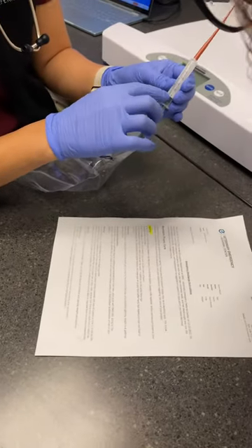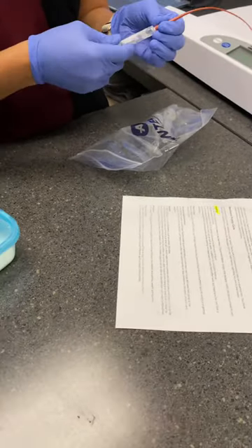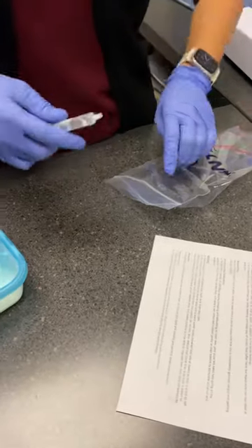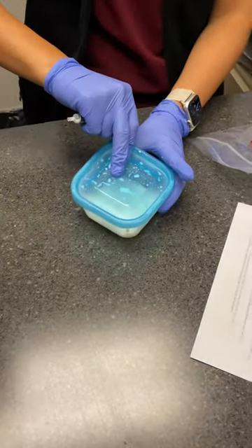We're gonna feed three mils every two hours. Just make sure you rinse it after each feeding. This is the milk we have in hospital, but you would have to purchase milk.